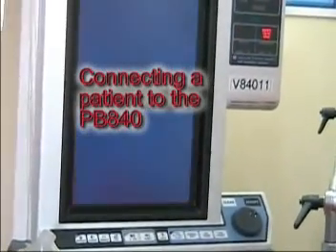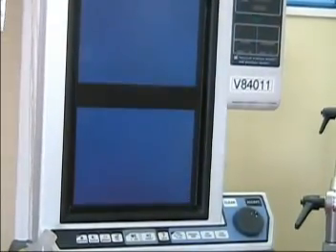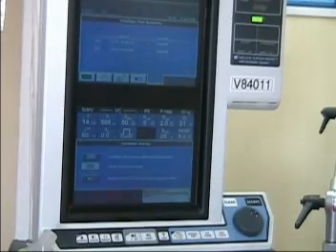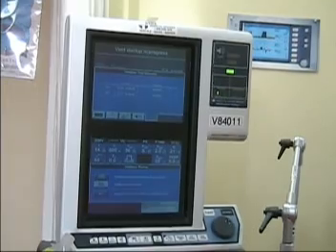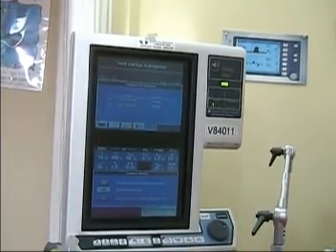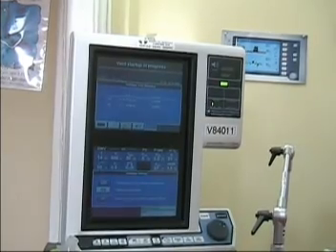Preparing to use the machine on a ventilated patient. We've turned the machine on and completed an SST.